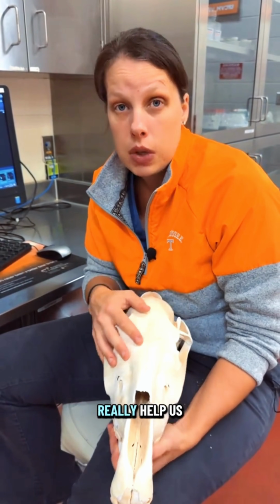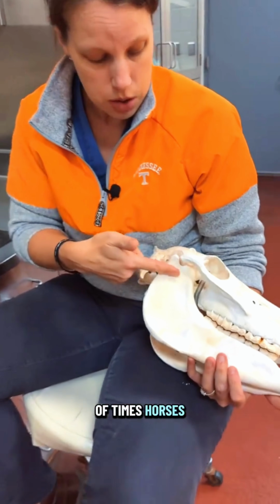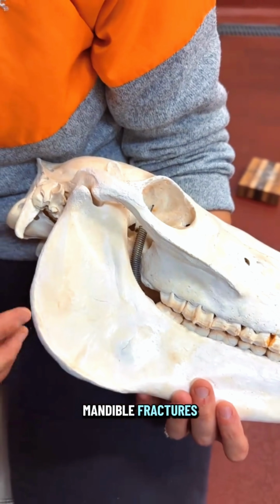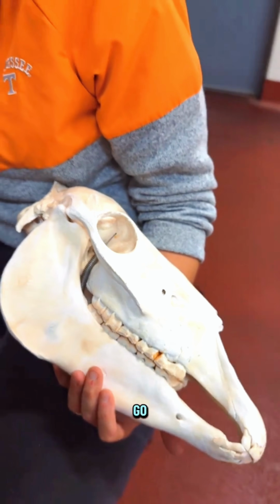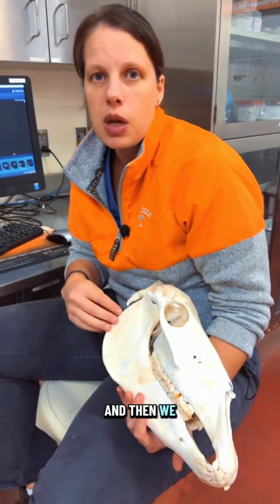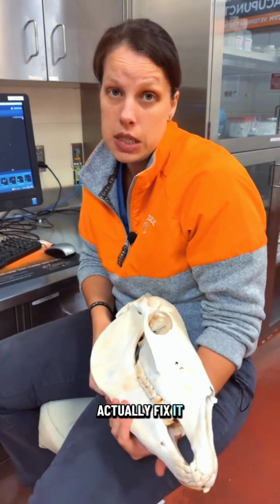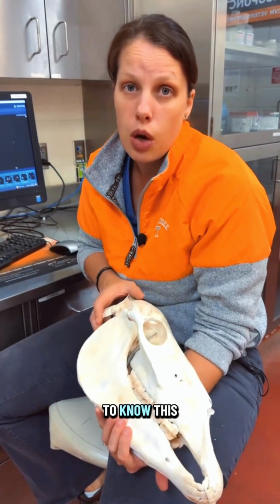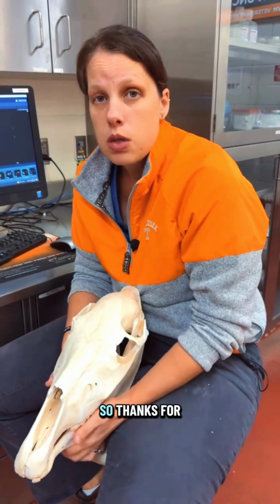The other thing that it can really help us do mapping is fractures. So there's a lot of times horses will get a fracture up here, the ramus of the mandible or mandible fractures. And on radiographs, it's really hard to tell where those fractures actually go, whereas when we do a CT, the truth is out. And then we know exactly what implant we need to do, or if it's okay to not actually fix it. A lot of fractures we don't have to fix if we have the proper imaging to know this is going to be a problem versus this one's actually going to heal on its own.